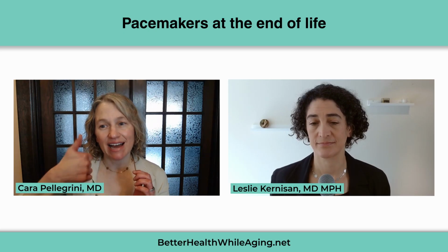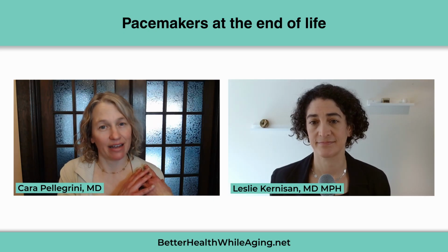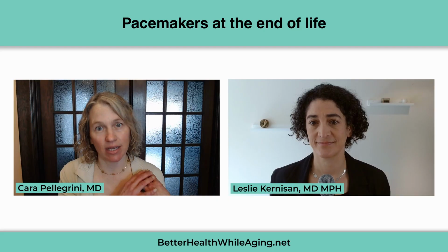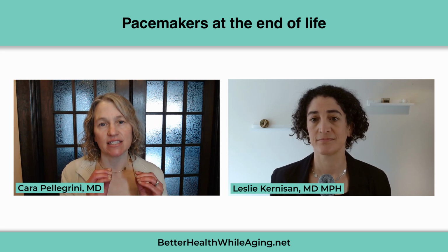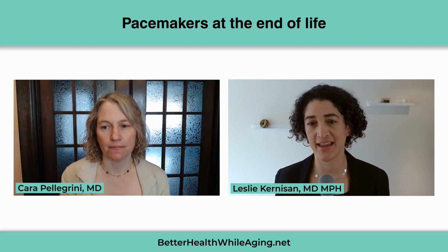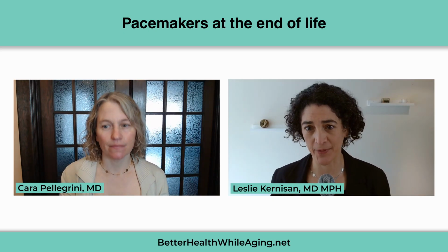And if the heart rate is not fast, the device, even the defibrillator still on, won't shock. So you can still die even with the defibrillator on, and you can still die even with the pacemaker on. It doesn't prevent that. The defibrillator with the shock function on is just preventing a death from a very specific, fast, life-threatening arrhythmia.